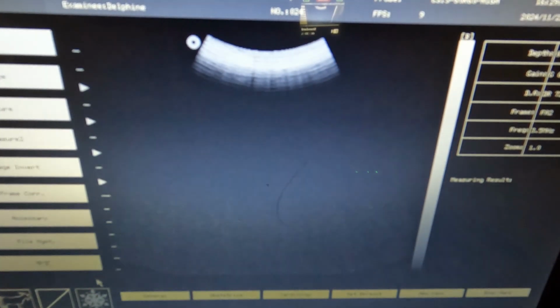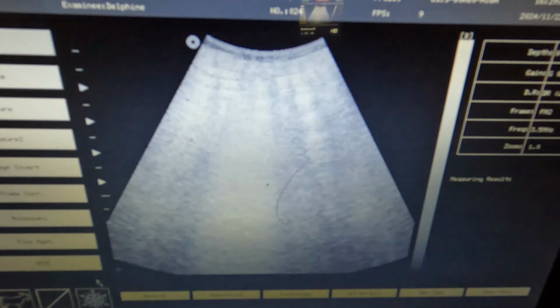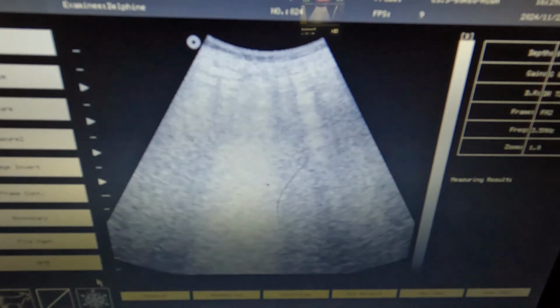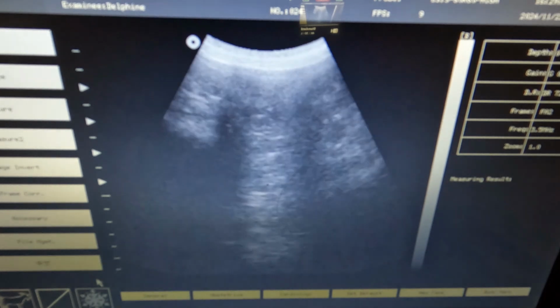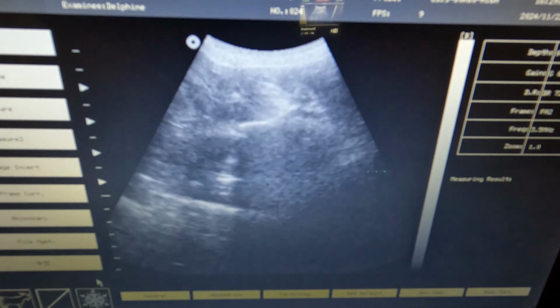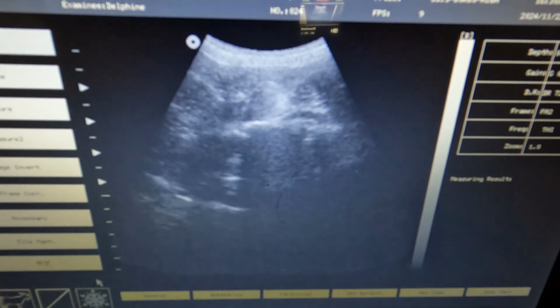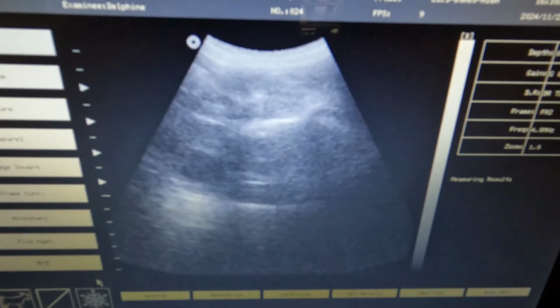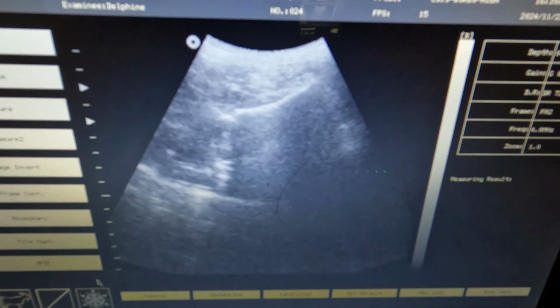Right, last one for the day is Delphine. She came in and walked across the laptop, the ultrasound machine, and knocked everything over. So we may have to play with settings again. Let's see. Ooh, that looks like possibly here. Let's change focal points.